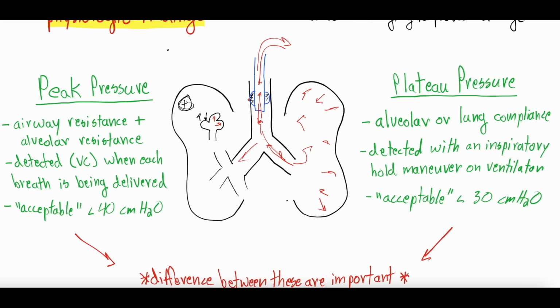So when we're evaluating a patient on the ventilator, let's just say you're prepping for rounds in the morning to present the patient to the attending intensivist, there are two pressures that we're interested in, right? The first is the peak pressure, and the second is the plateau pressure.